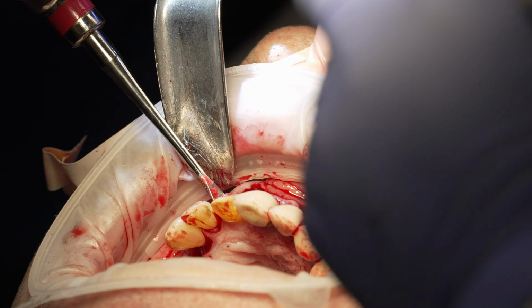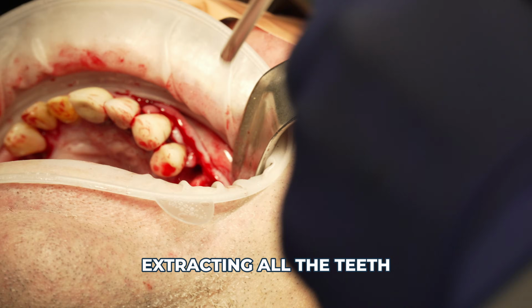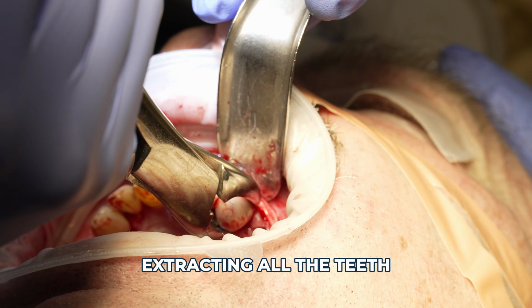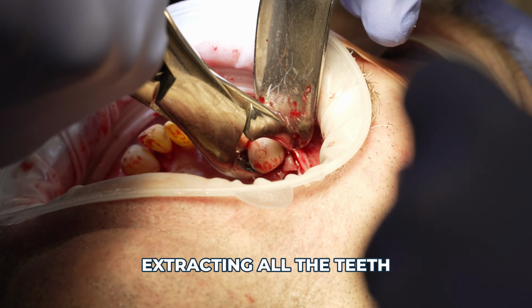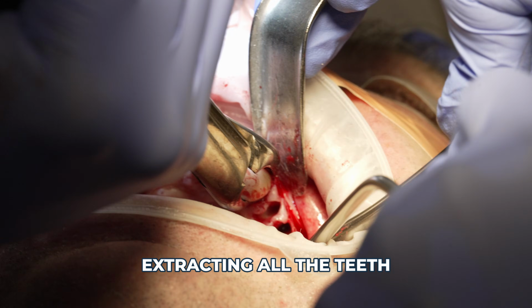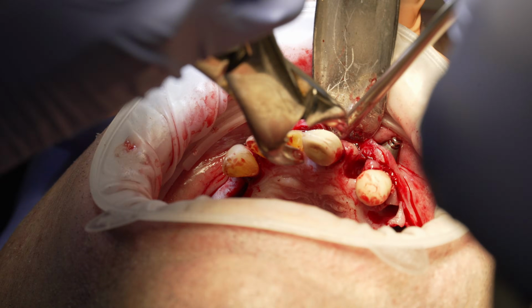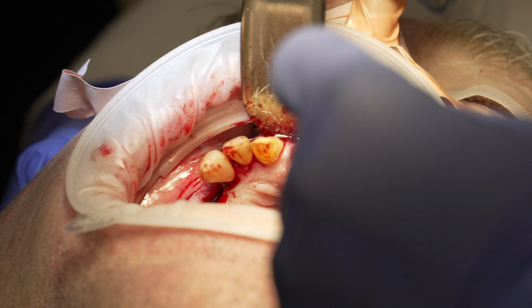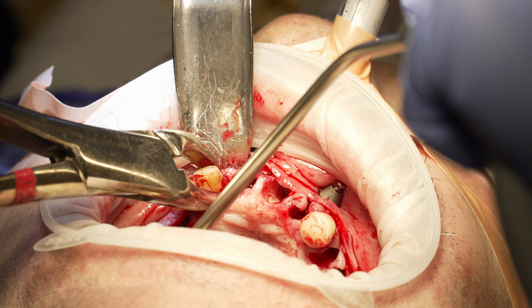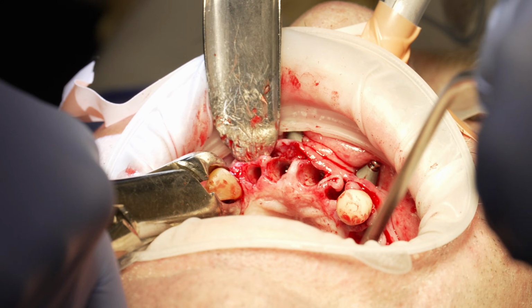And so with those pencil marks in place, we finally start pulling the teeth. You'll notice that his teeth actually are already kind of loose, and this is because the patient has gum disease. In fact, just for your information, most people end up in dentures because of gum disease, as opposed to rampant cavities or trauma or other things. And that's helpful in this case because the teeth are going to come out relatively easy, as you will see here, and that's because the gum disease has done a lot of the work for us.